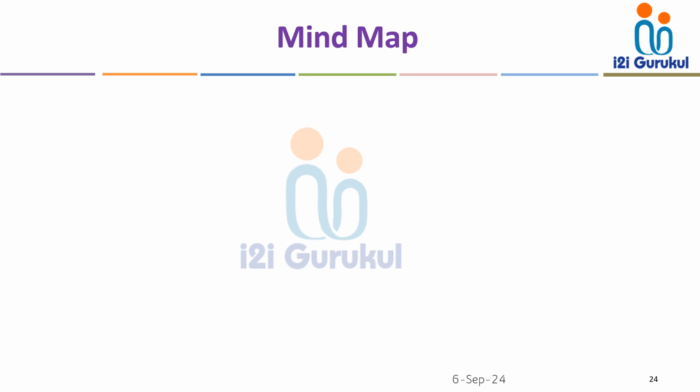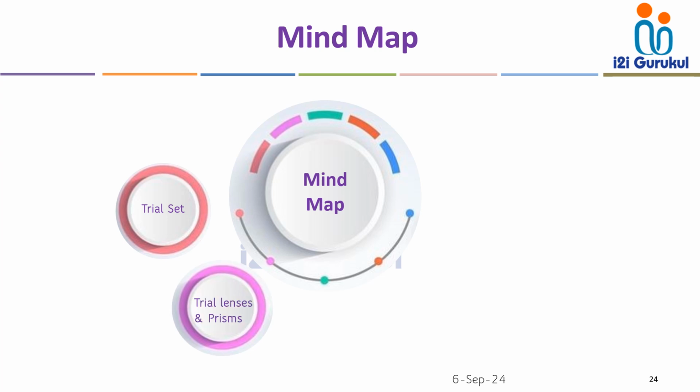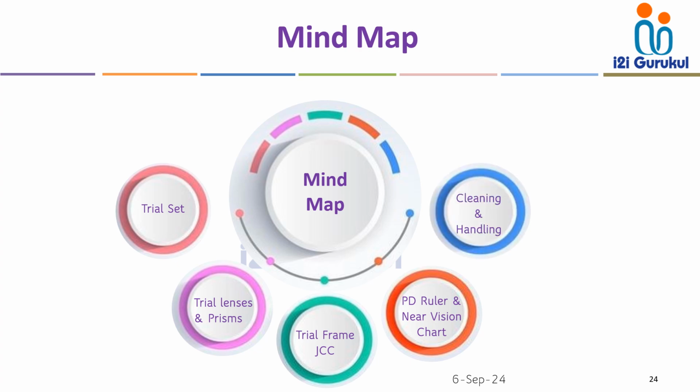Coming to the end of this session, we will see the mind map of this program. Initially we discussed the trial set, trial lenses and prisms, and then we discussed trial frame adjustment, Jackson cross cylinder and its uses, PD ruler and near vision chart, and finally we discussed cleaning and handling of these trial sets.